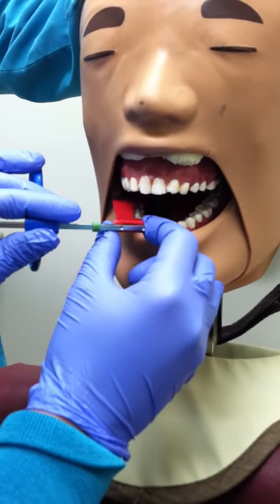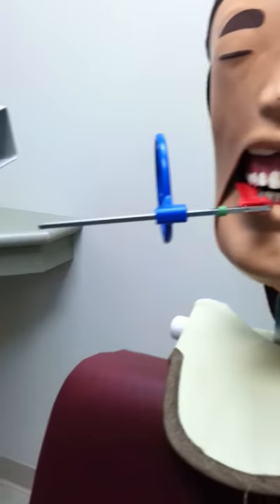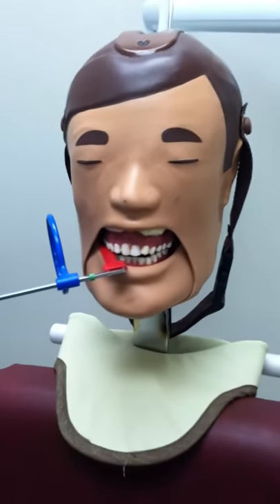Have the patient bite down on the bite block and push the ring in close proximity to the patient's face without touching. Tell the patient to not move in order to reduce the chance of a blurry image.